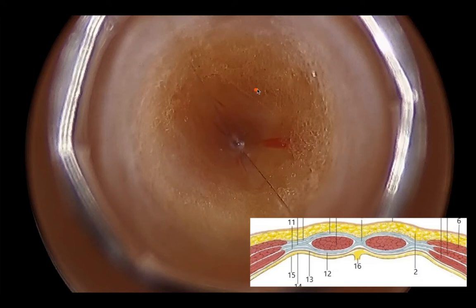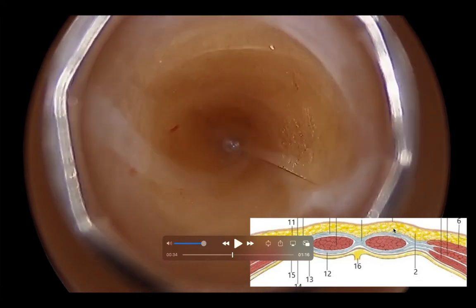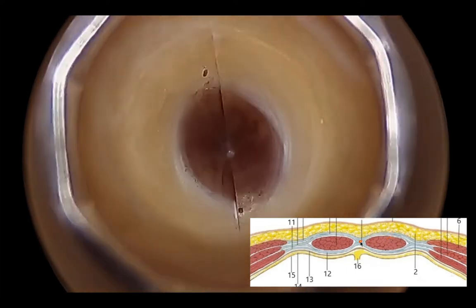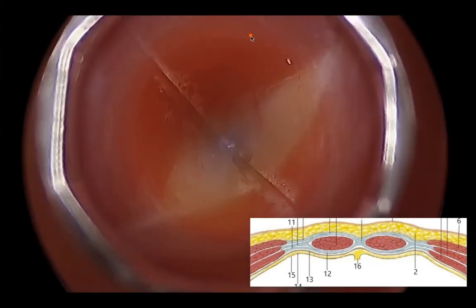We're in the yellow subcutaneous fat — this is mostly yellow here. You can see a little blood vessel, but we're resting in here and working our way down. Here you start to see this white layer on the outside — that's the splitting anterior rectus sheath. And then you see this red muscle showing up as the tip of the trocar extends down into the rectus abdominis. Now you can pretty clearly see these are obvious big red muscle bellies that have started to split, so the tip is resting somewhere in the rectus abdominis. We're starting to get our first hints of the white posterior fascia — the posterior rectus sheath right in here.